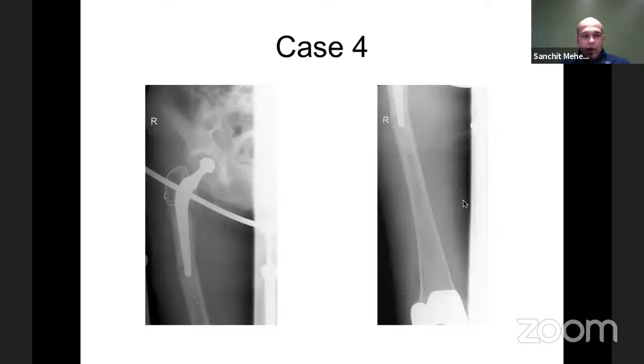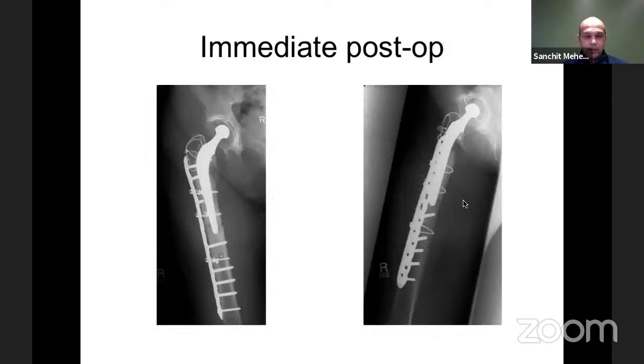And then there are times when things don't go to plan. So this is the sort of B1, B2 controversy. Similar fracture, but this is a much older case. You can see that it's a Charnley type stem with the transtrochanteric approach, and the fracture is transverse around the level of the tip of the stem with a distal knee replacement. So the choice was rightly made in that scenario, you could argue, in the first instance, to fix this.